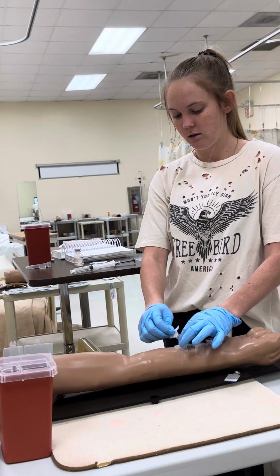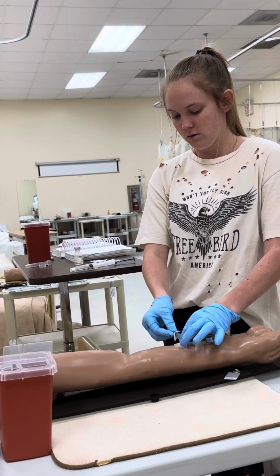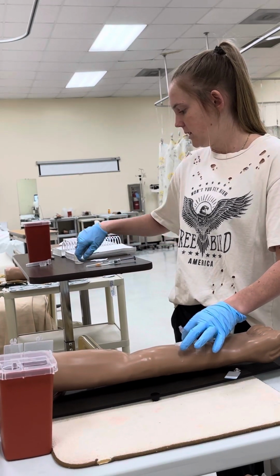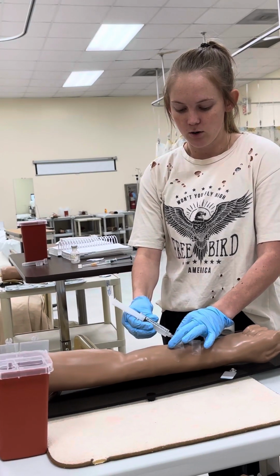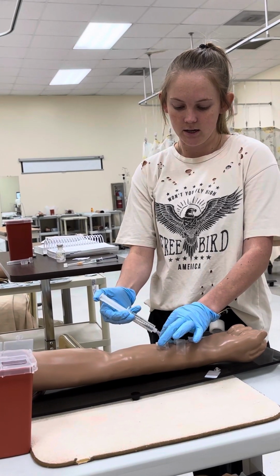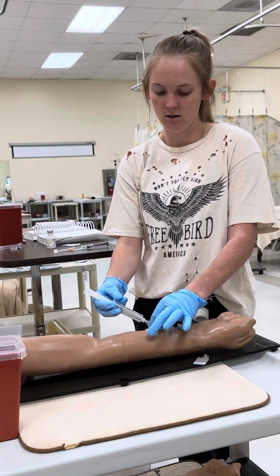I will then clean the rim and the tip of the INT. I'm then going to connect my normal saline, and I'm going to aspirate and then flush and prep the line.